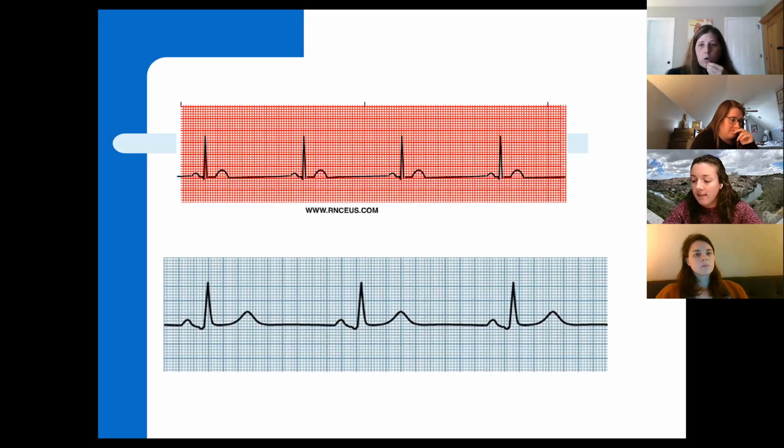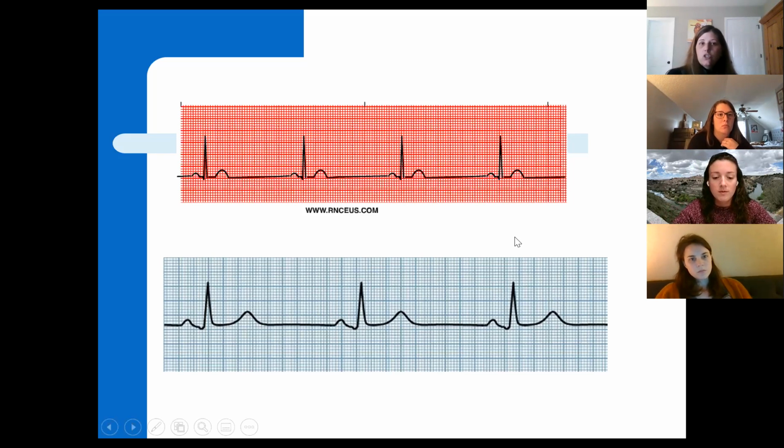The EKG questions that you see on the first test blueprint, and all of the subsequent test blueprints, are outlined on there. Those are actual strips where we say, tell us what this is, okay? And on those questions, you get a drop down. When you hit that drop down, it might have 20 different rhythms, or 20 different possible answers, and you pick the one that identifies the strip. So EKG questions are going to be a strip, and you tell us what it is.